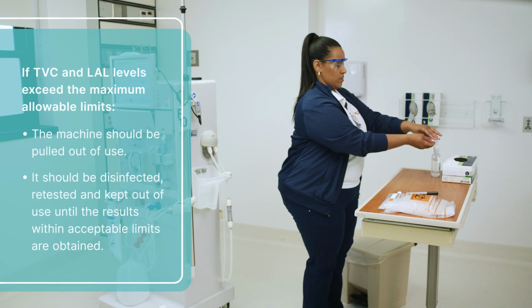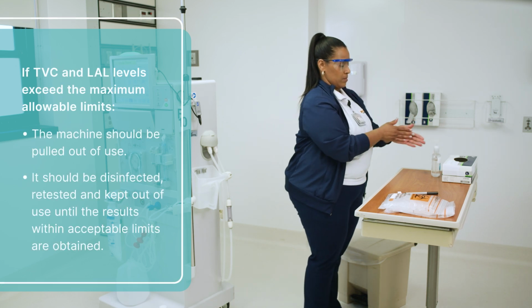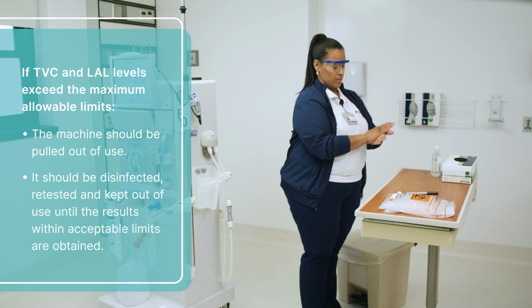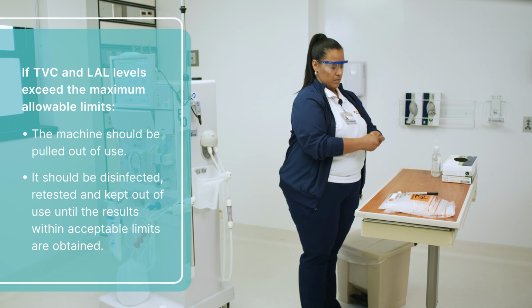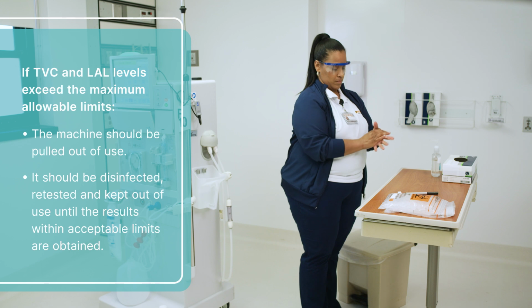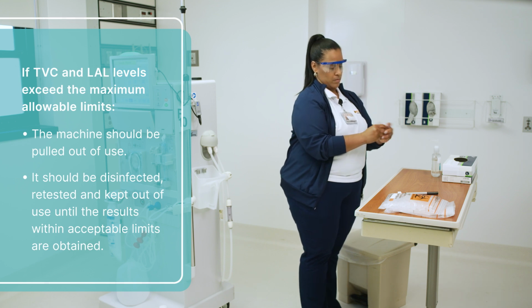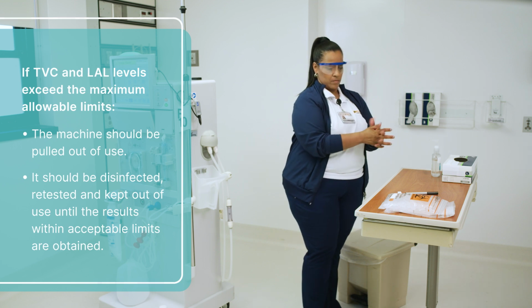If the test comes back with levels that exceed the maximum allowable TVC and LAL levels, the machine should immediately be pulled out of use. Collaborate with appropriate leadership and departments within your facility to determine the best course of action. The machine should be disinfected, retested, and kept out of use until sample results are back within the acceptable limits.